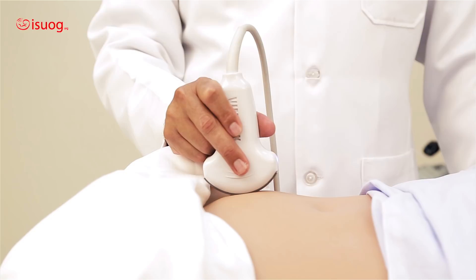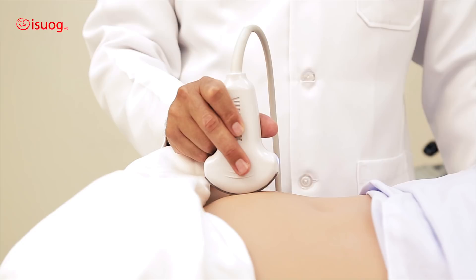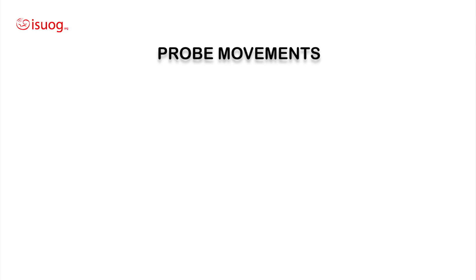It is crucial to hold your probe perpendicular to the maternal abdominal surface. This will ensure that you are examining the structure underneath the probe. I am going to demonstrate four important probe movements: sliding, rotating, dipping, and angling, as well as a combination of some of these movements.